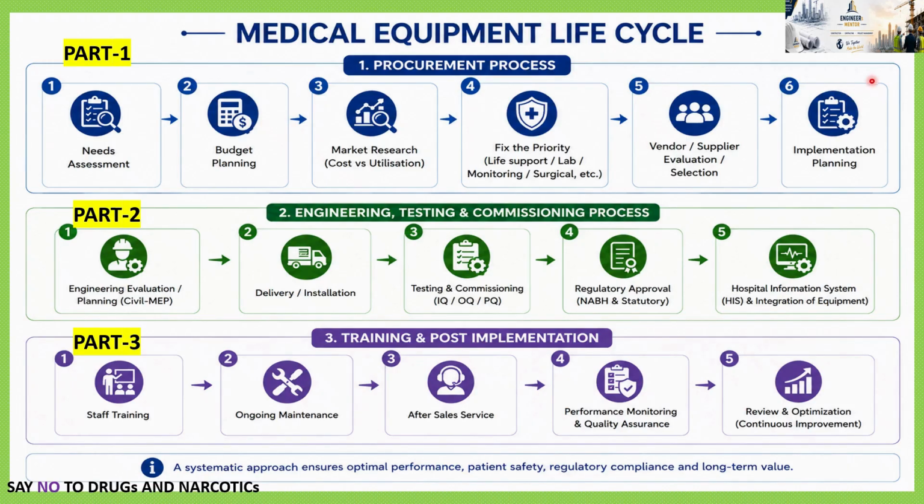In order to make each stakeholder understand the procedures to be followed in the medical equipment life cycle, I have divided the entire activity into three stages. First is the procurement process, then the engineering, testing, and commissioning process of the equipment, then training and post implementation of the process.